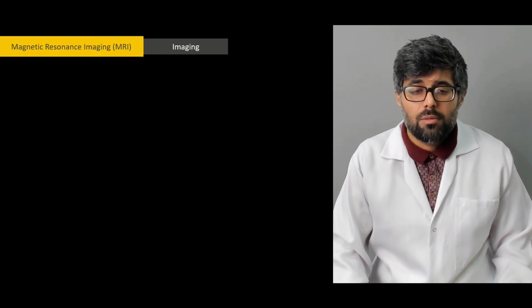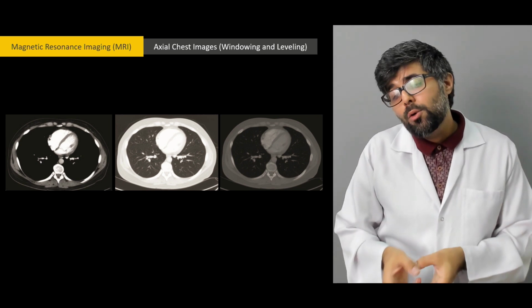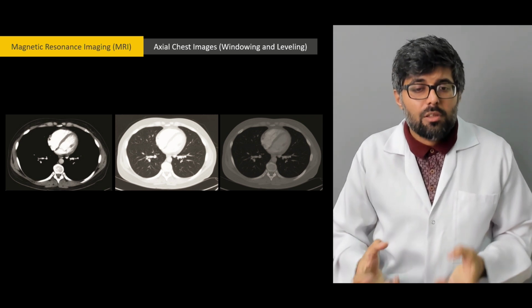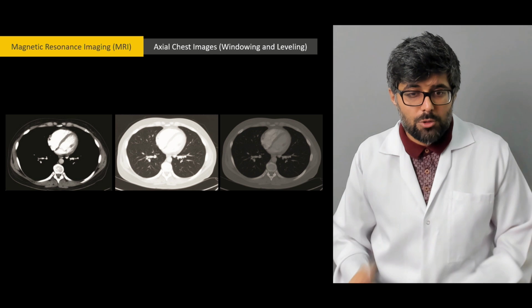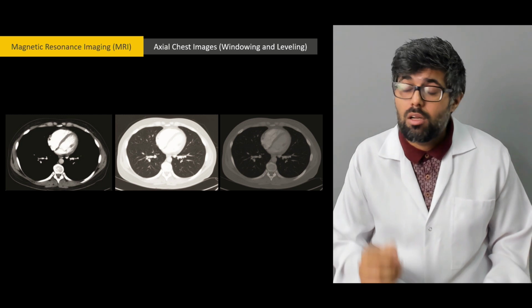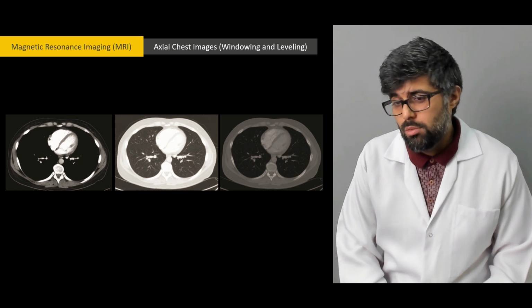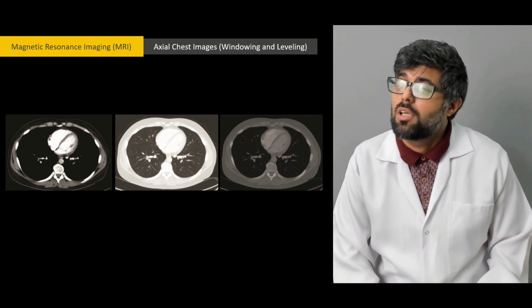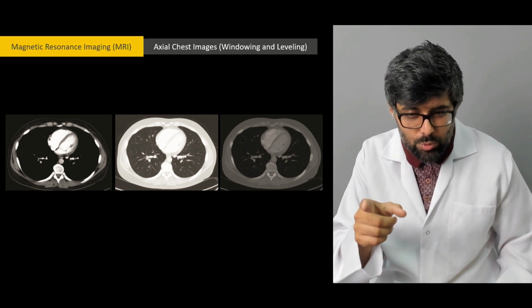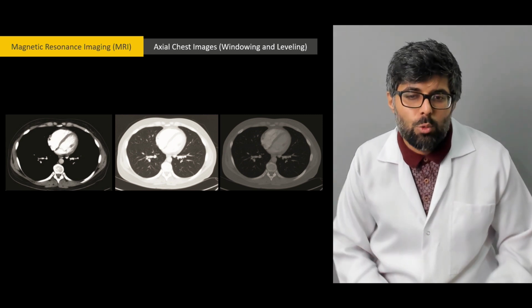In the second one, we are using a lung window. In the lung window, only those grayscale are selected which corresponds to the lung. So in the second image, the lungs and the pulmonary veins are a lot more visible. The third one is the bone window. In the third one, bones are a lot more clearer. You will notice the costal bones. You can see both the cortex and the medulla.